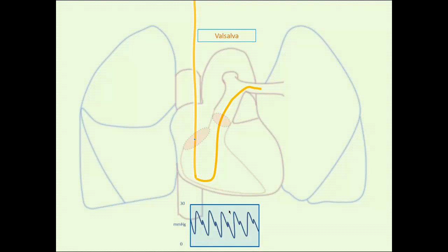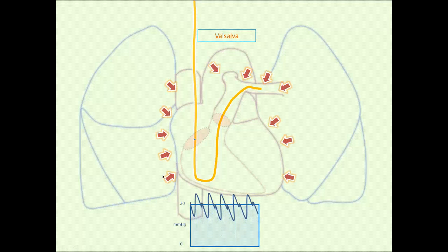So this is your pulmonary artery pressures that you're measuring. This catheter is in place. Now let's say, hypothetically, I've floated this PA catheter in one of those Olympic weightlifters, one of those huge guys that's about to lift a school bus over his head, and you are measuring his PA systolics as he lifts this massive amount of weight above his head. Well, what you're going to see is a dramatic increase in the pressure around the heart and blood vessels and lungs. The whole thoracic box is pressurized, and your PA pressures will increase.